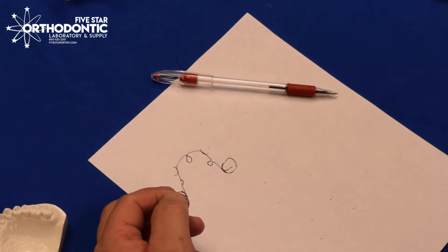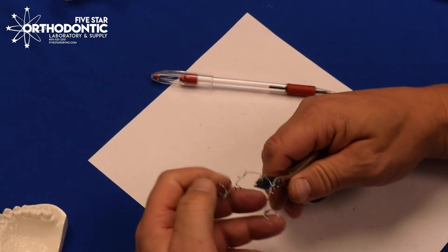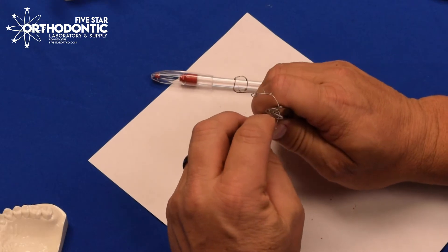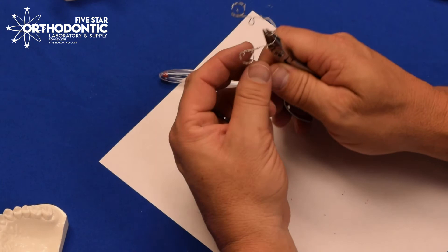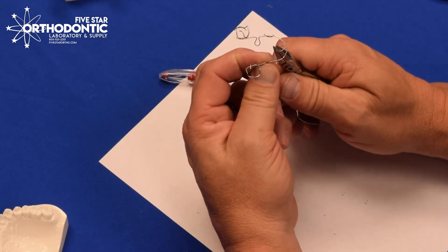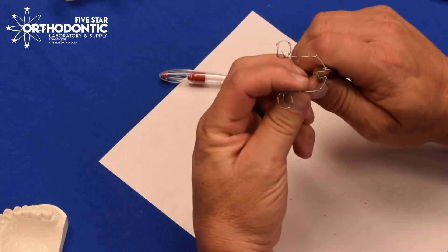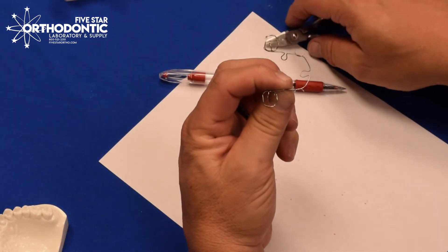For the first activation, you can either use a flat-on-flat or a Jarabac plier. You come inside the omega, keep the appliance parallel — your plier can be crooked, just keep the appliance parallel to the table. As you squeeze, that will activate the bicuspid area. If you notice, the molar area is coming in. That's your first activation.